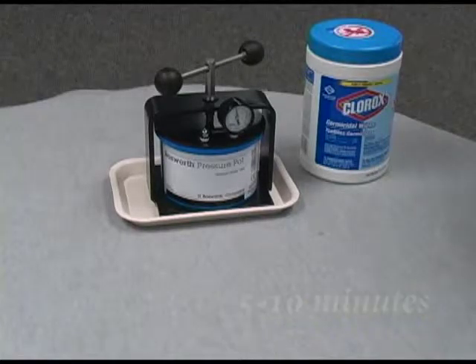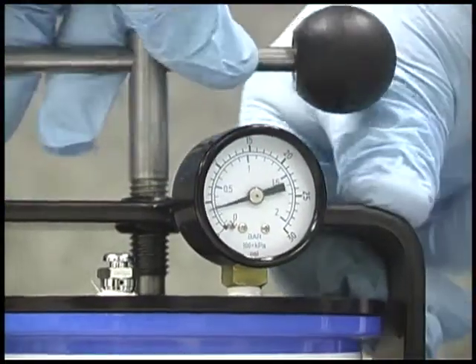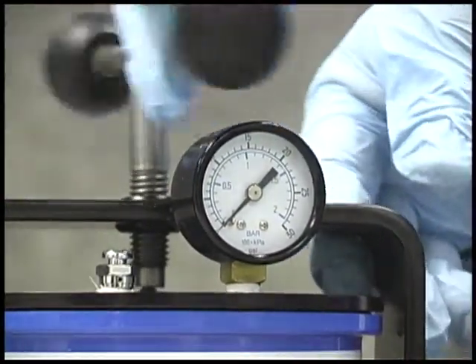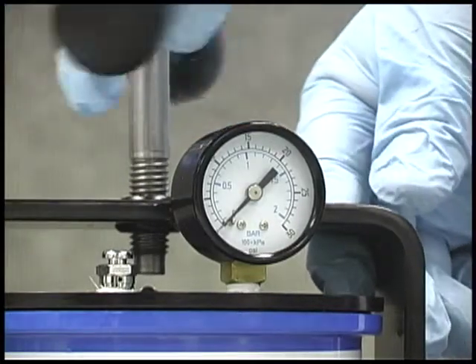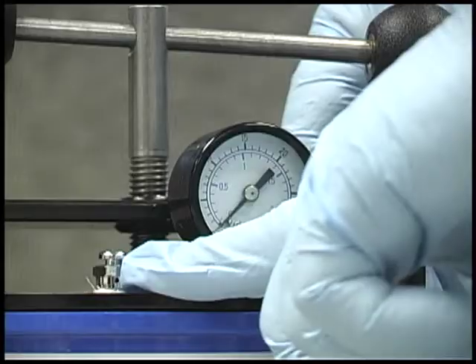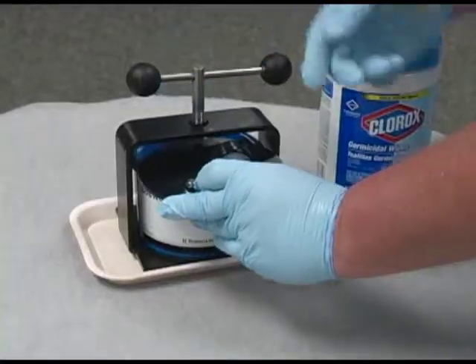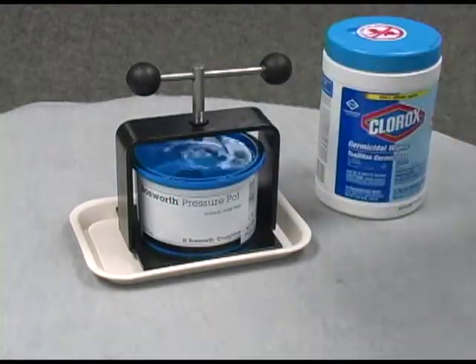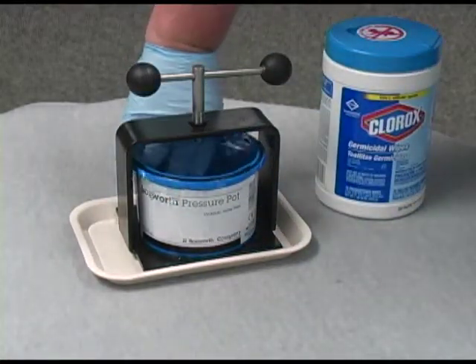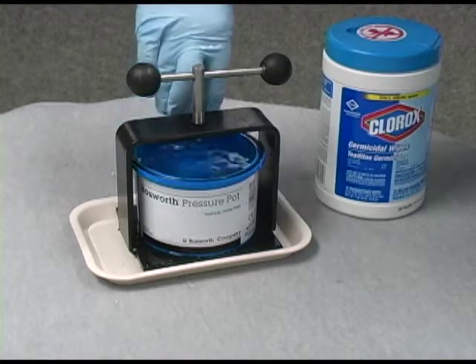To remove the appliance from the pot, first release pressure by turning the handle counterclockwise or by pressing the pressure release valve. The gauge should read 0 PSI. Remove the lid of the pressure pot and then remove your acrylic appliance.